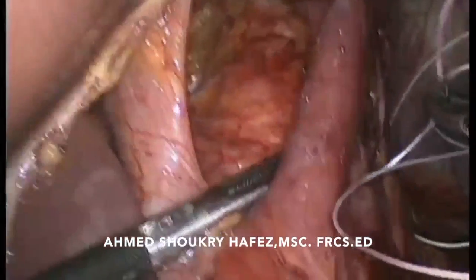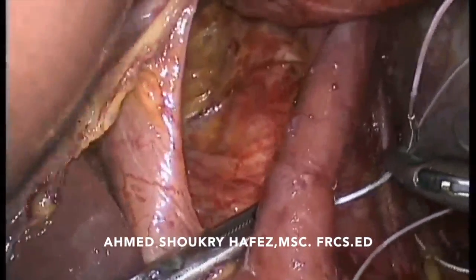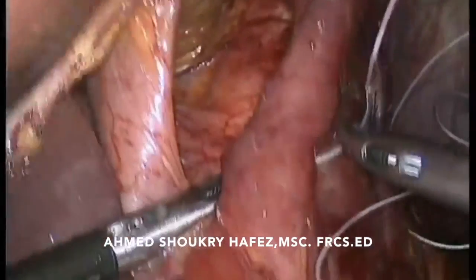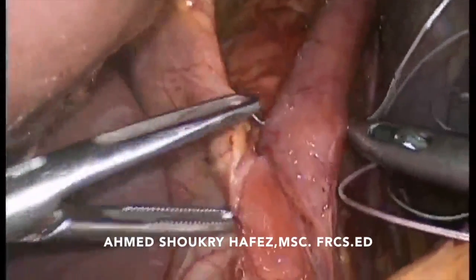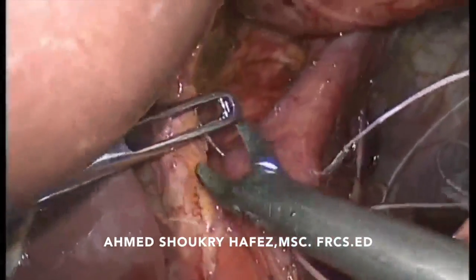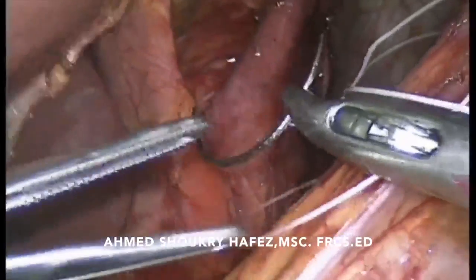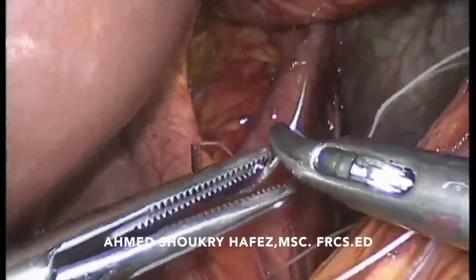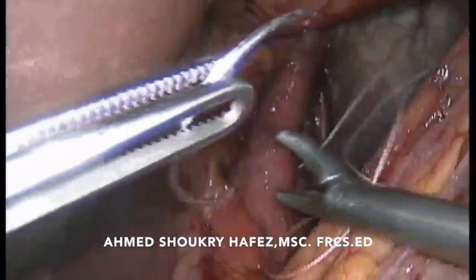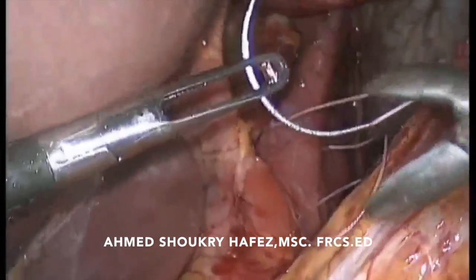Now that we have completed the mobilization of the wrap and the posterior retrogastric tunnel, we start closure of the crura. The first stitch must be very careful, as it is the closest to the thoracic aorta, and it must be placed with great care.